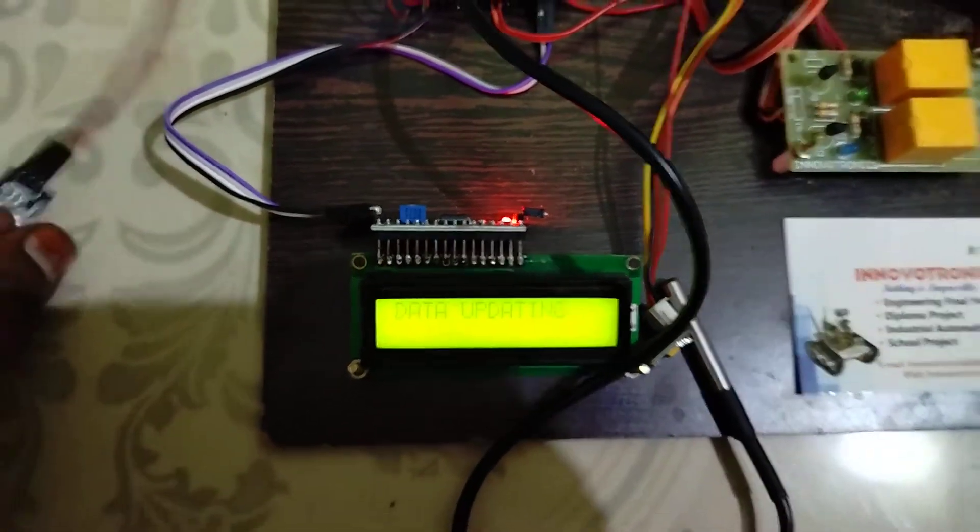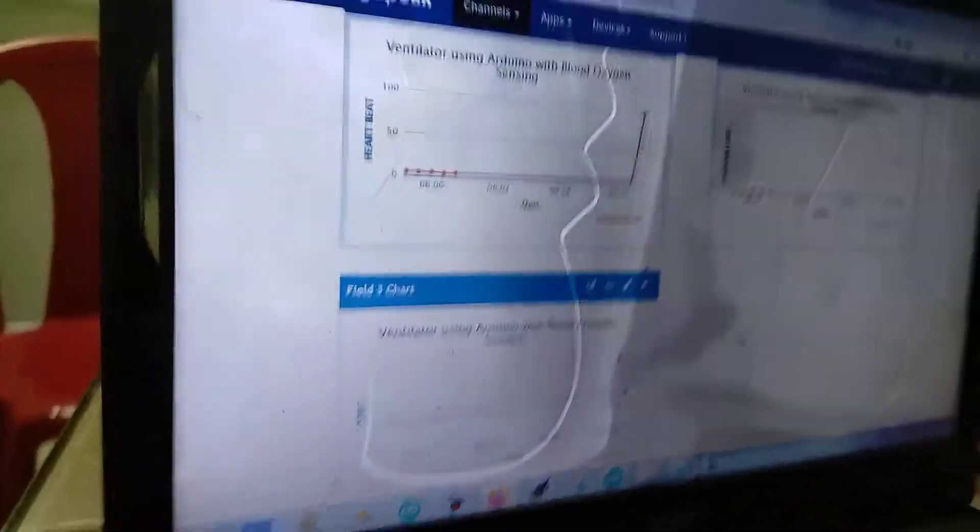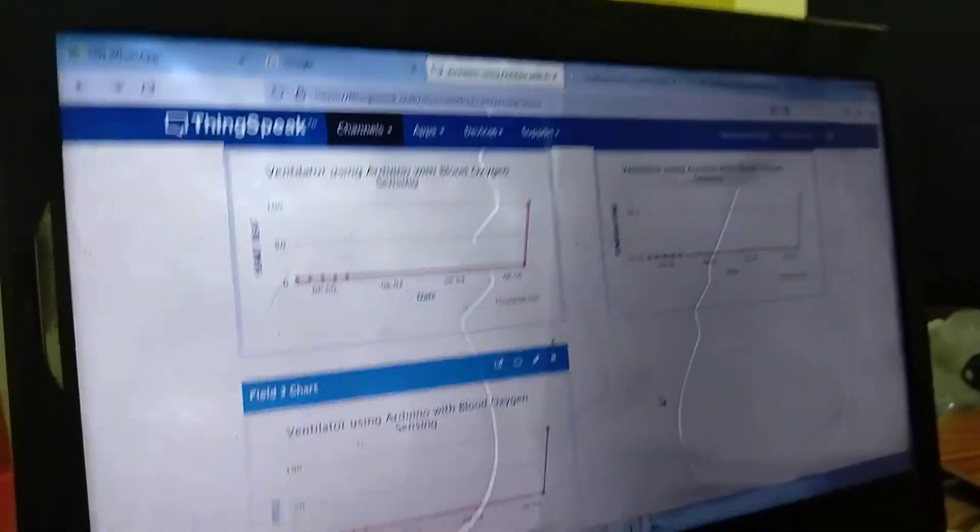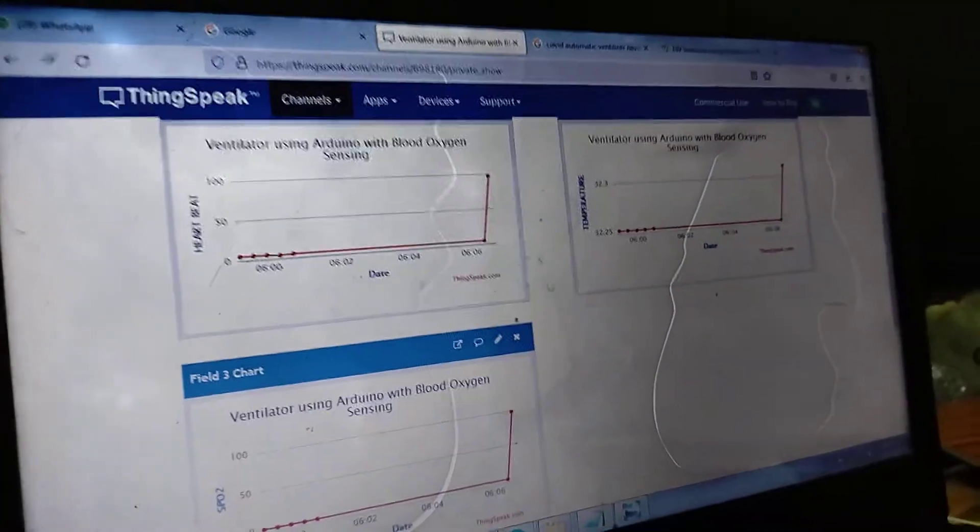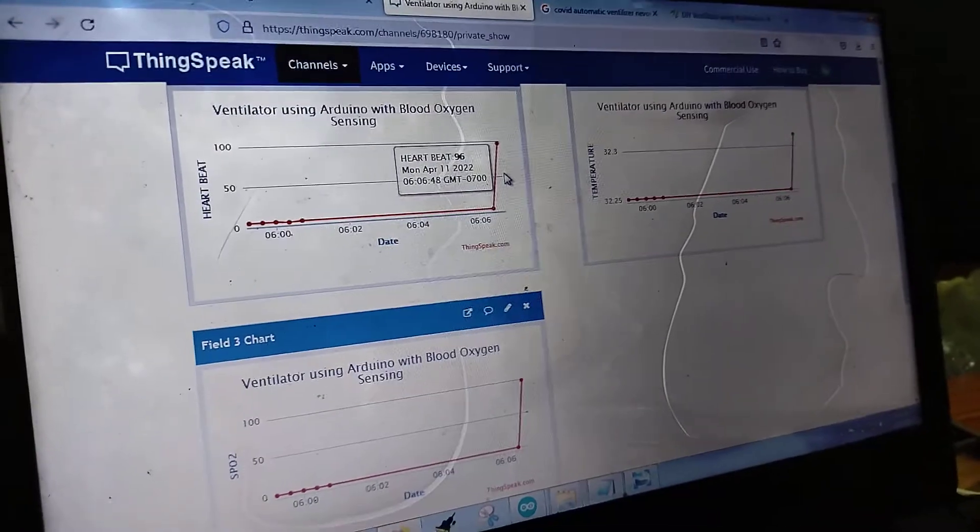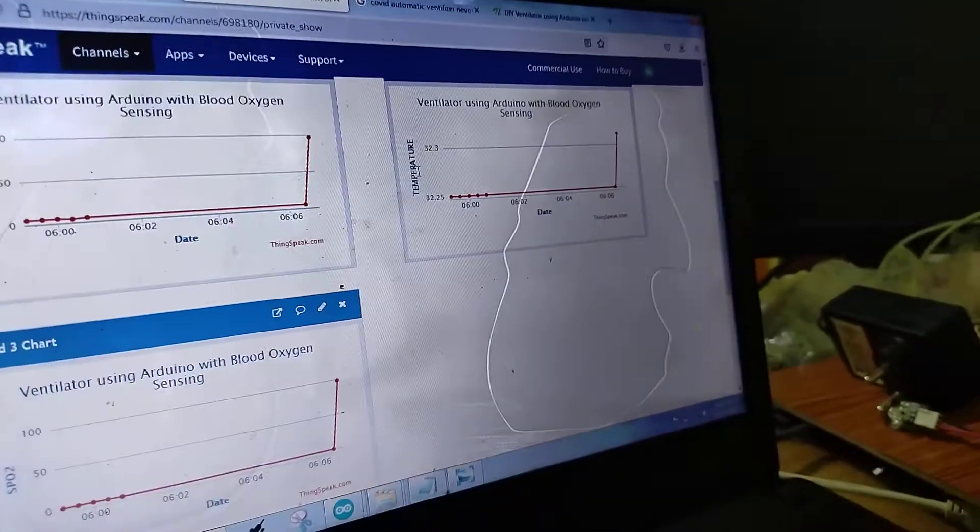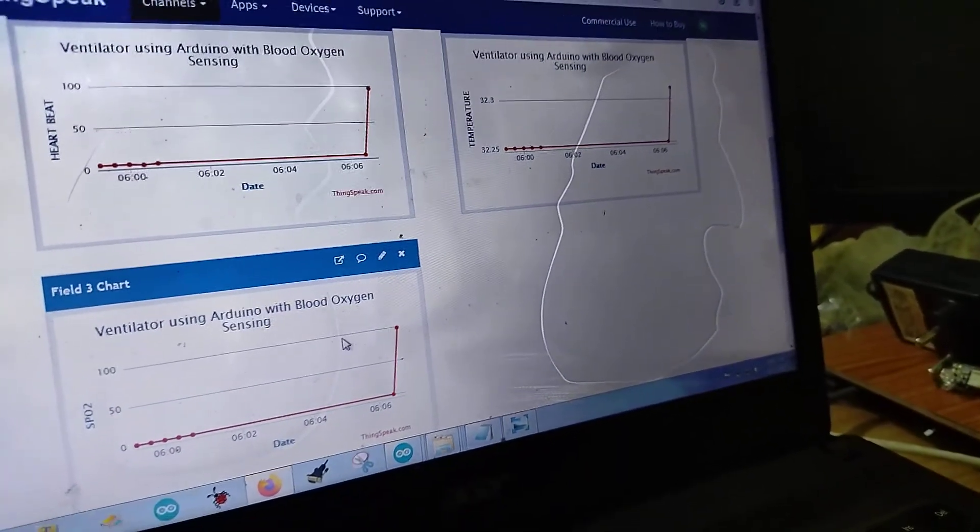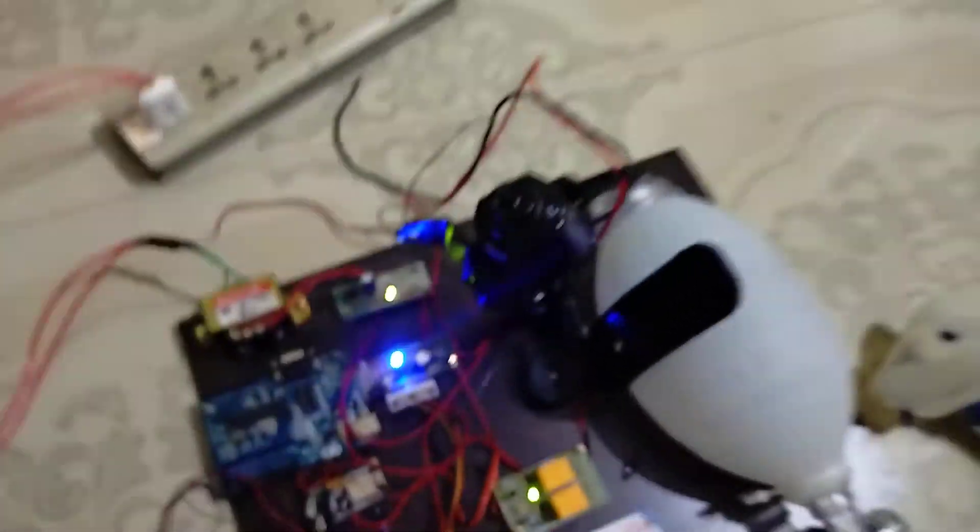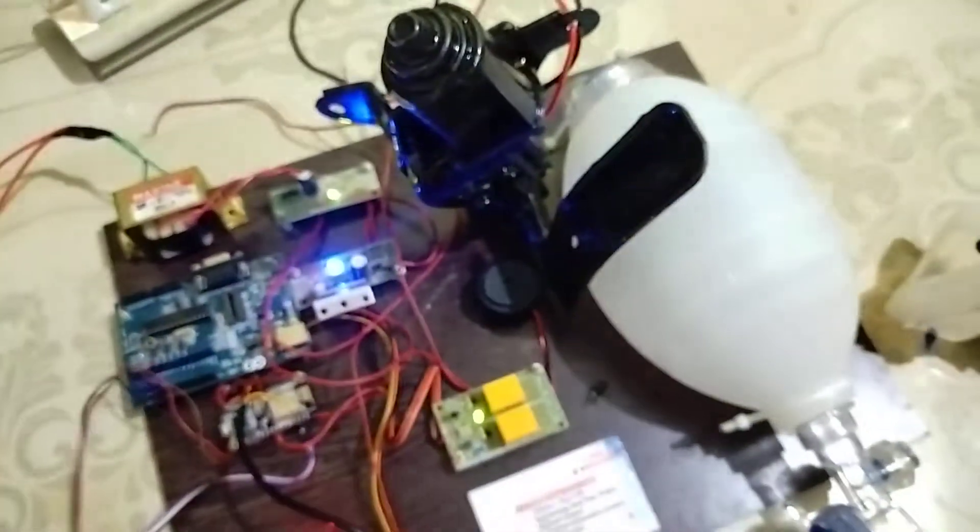Here's the website. We are using ThingSpeak site. This is the ThingSpeak site where you can monitor the data. This is the heartbeat, this is the temperature, and this is the SPO2. Now I'm going to show the ventilation unit.